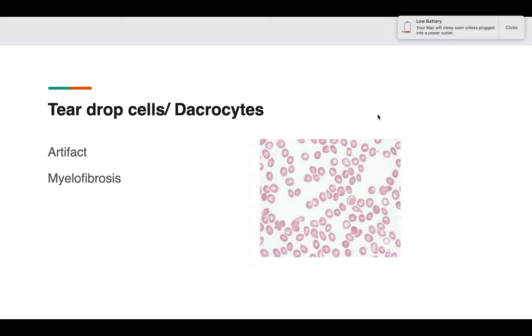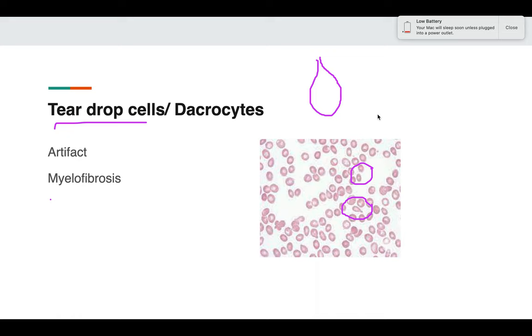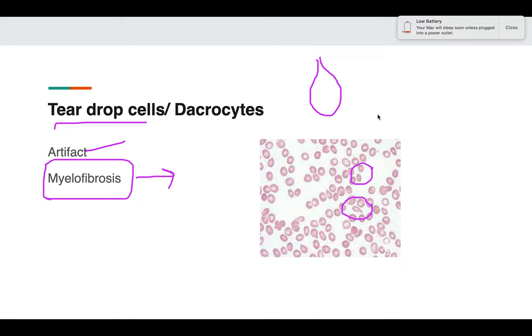Tear drop cells — as the name suggests — appear like a drop. They are very characteristic of myelofibrosis, but can be artifactual also, so the history of the patient is important. If you see many tear drop cells in an older person, myelofibrosis should be considered. Tear drop cells are also known as dacrocytes.